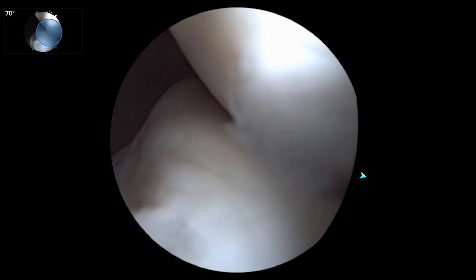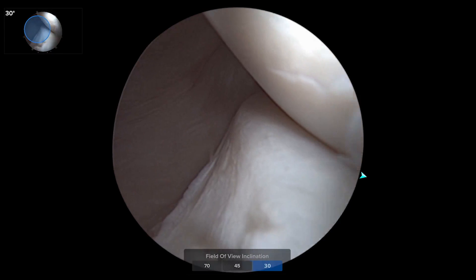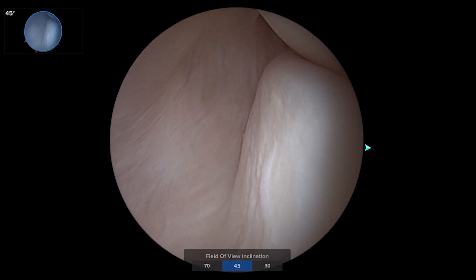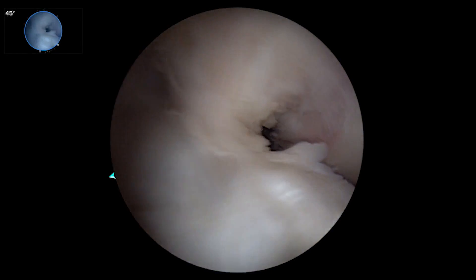Coming into the root area at 70 — not such a great view. Go to 30, our typical view. Go to 45, and you can see all the way around this posterolateral corner. So again, just views you're not used to seeing, all with the touch of a finger.